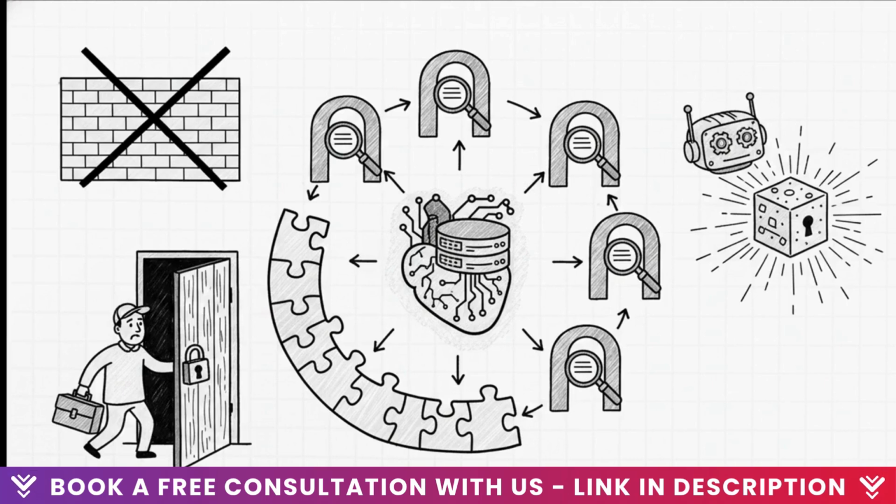Your platform must be locked down with zero trust principles, where literally every request is verified and strict network segmentation is enforced. Plus, when you're training or utilizing AI, you need privacy-preserving frameworks. We're talking about federated learning, which trains models across decentralized datasets without ever moving the raw images, and homomorphic encryption, which actually allows computations directly on encrypted data. You also have to implement continuous vendor risk management, because a compromised third-party maintenance account can easily become a backdoor right into your hospital network.